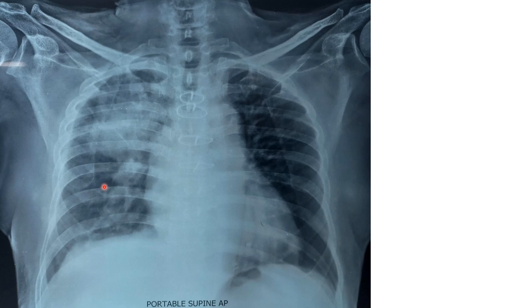Characteristics of malignant nodules include: first, they tend to have larger sizes, though malignancy can occur even at small sizes. Second, the shape — malignant masses usually have an irregular shape with spiculated margins. Third, calcification can be present, and the pattern is irregular, diffuse, punctate, or eccentric in malignant masses.